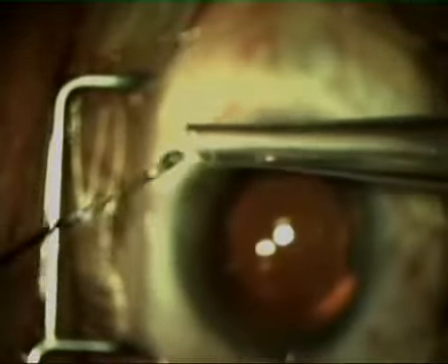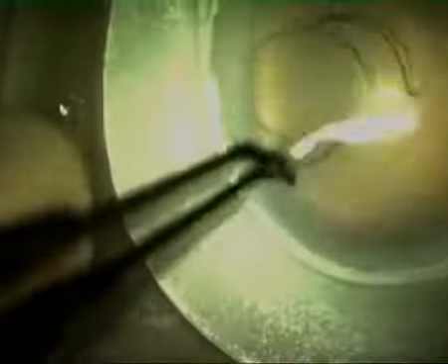Viscoelastic, or OVD, is sparingly applied to the injector loading bay to lubricate and facilitate the injection process. The injector nozzle is also filled with a viscoelastic. Now we see the lens being lifted from the blister pack by a pair of non-serrated forceps, such as Kellman-McPherson's.